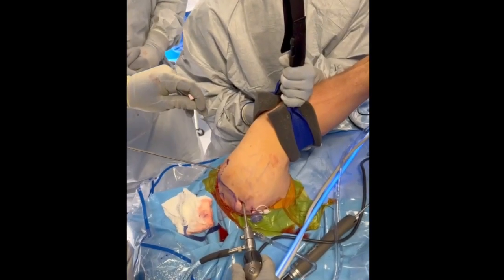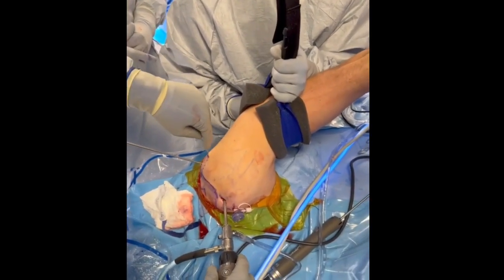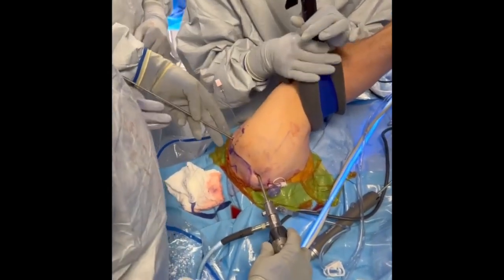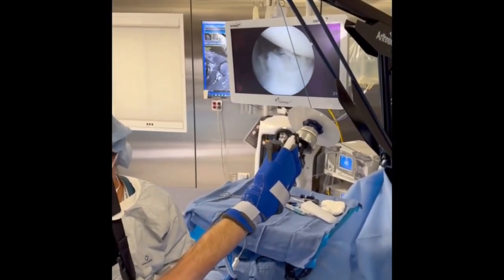A 17-gauge spinal needle contained in the percutaneous kit is used to localize this portal under direct visualization and confirm satisfactory angle for anchor insertion. If the portal is too medial or parallel to the glenoid, this increases the risk for damage to the cartilage when drilling for the anchor.